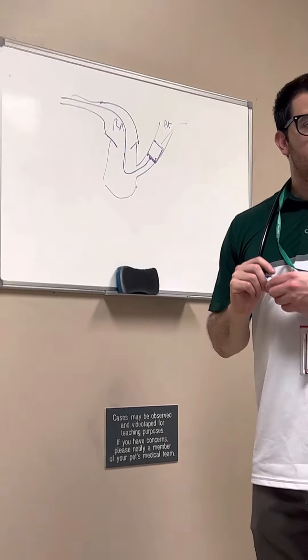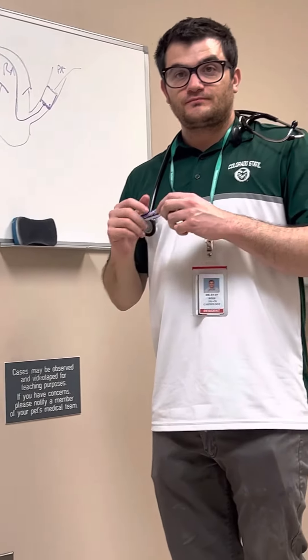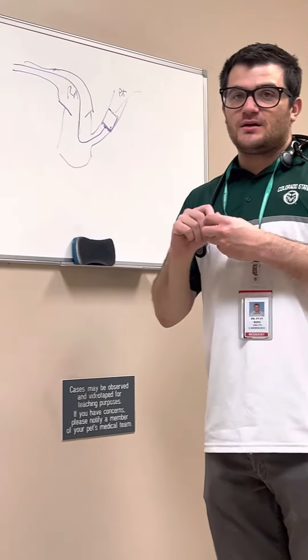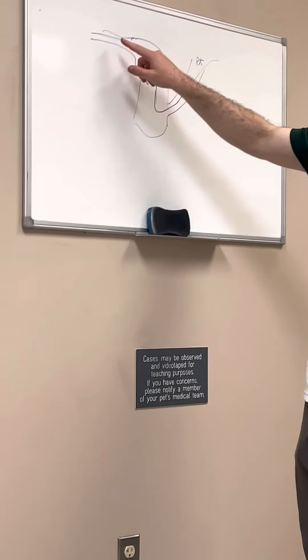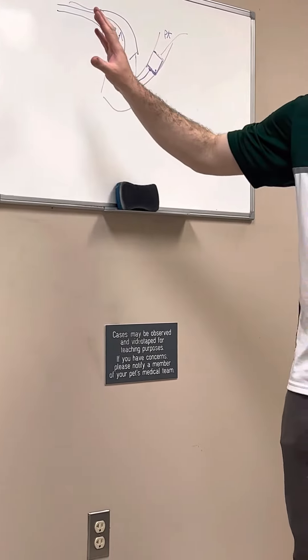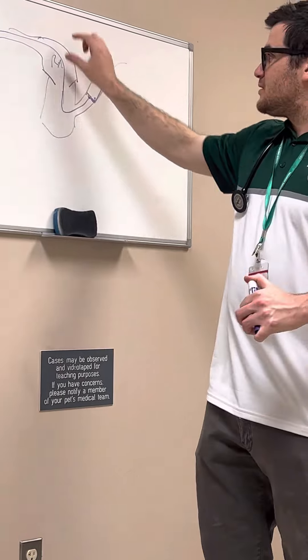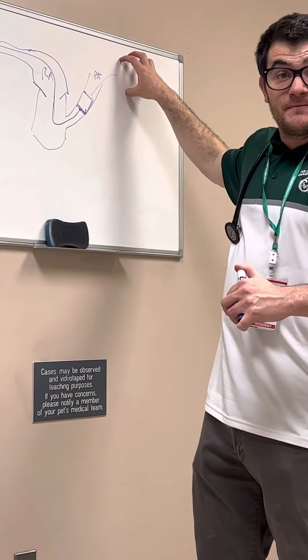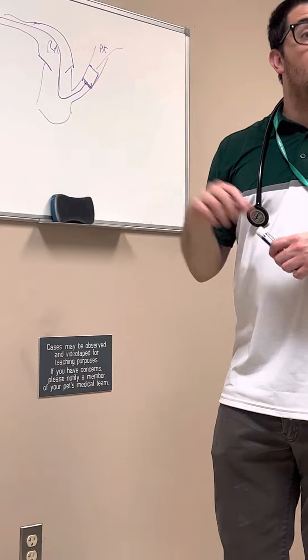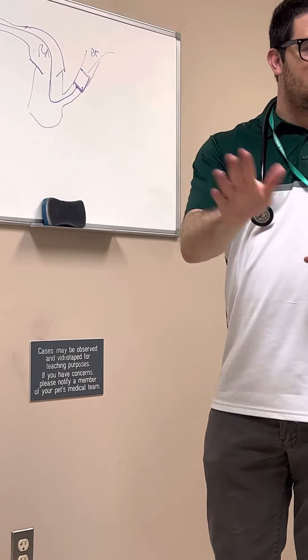Is the wire kind of so you can guide it better? Yeah, the wire is to me, I think of it as kind of like a train track. So once the wire is out into her lungs, then we can advance catheters and sheaths over the wire, just kind of like a railroad track to get out to the right spot.